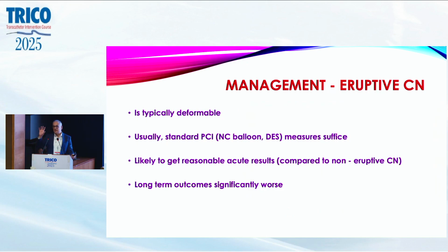Now, the difference, as I said, is whether a calcific nodule is deformable or not. So an eruptive calcific nodule by its very nature is deformable typically. Therefore, you can treat it using standard percutaneous intervention techniques. So you do not typically require any advanced level of intervention. You can get away a lot of the time with standard non-compliant balloons, and your acute results are very good.